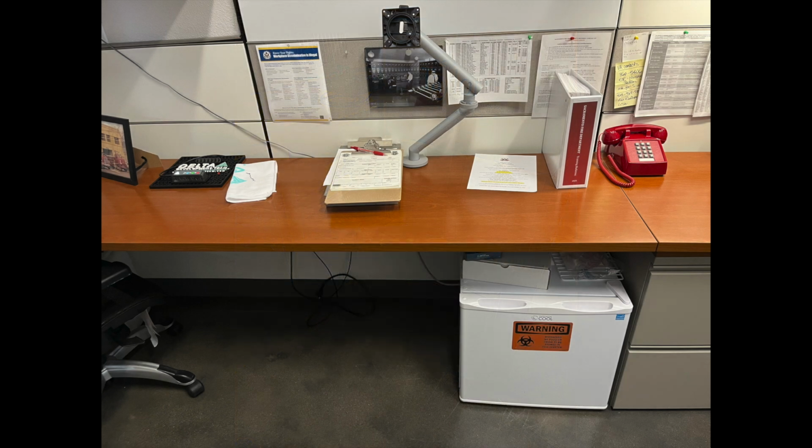This is what EMS 23's location looks like. Same thing. You've got the cooler on the floor. You've also got the temp mat on the table. Those temp mats have to be on a very firm surface, so the table or the counter are the only ones that are going to work. Don't put it on a box.